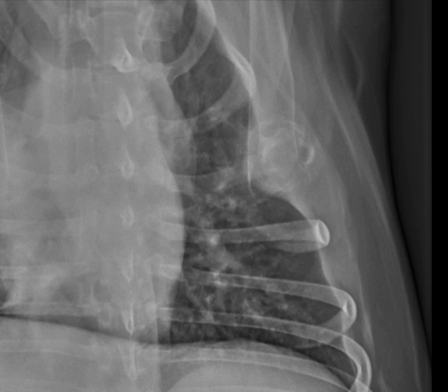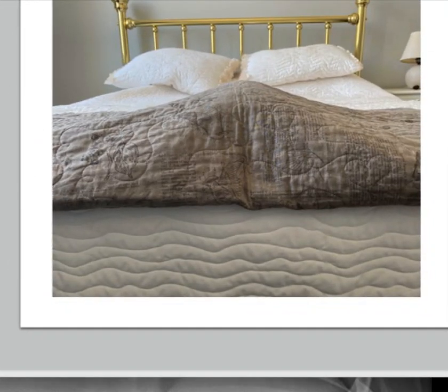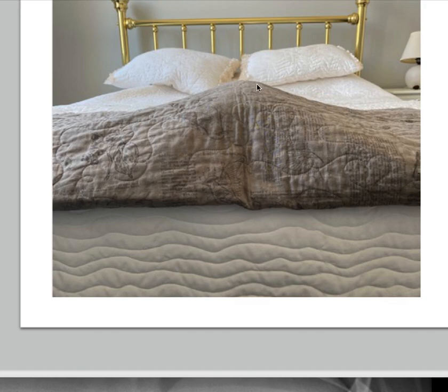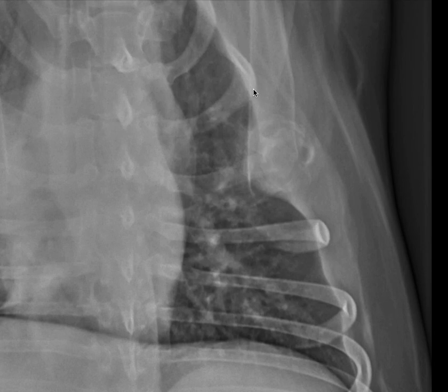To illustrate this more clearly, please welcome my cat. Here you can see that when he's relaxing on my spare bed at my house underneath the quilt, his body creates this gentle curve, and the differentiation between where his body starts and ends is quite gradual and ill-defined. So is the case for the extrapleural sign, where as we trace this line, we see it's a very gentle appearance.